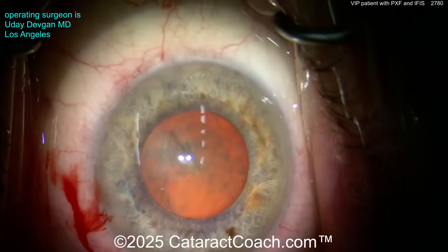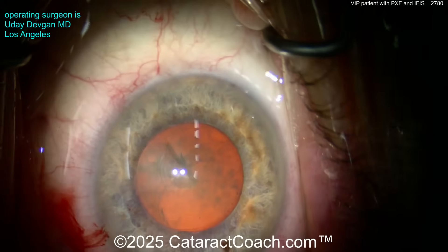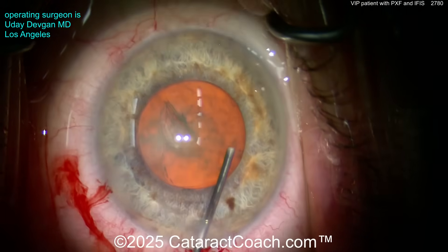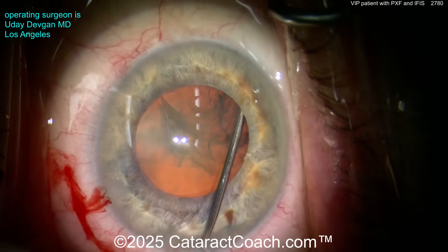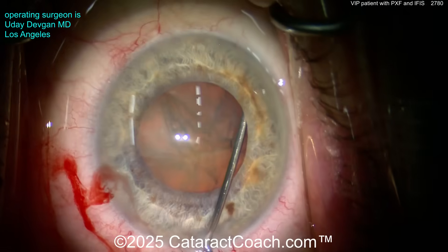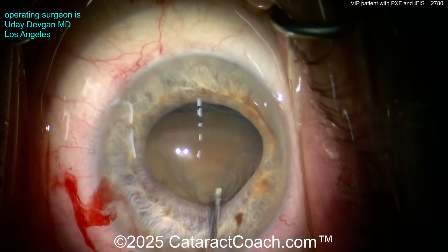There it is — we've got a nice-looking rhexis done. This is a complete cataract case shown start to finish, so I'm going to show you everything. Now you can see the red reflex is optimized — just two Purkinje images from the two coaxial illuminations at the cornea.